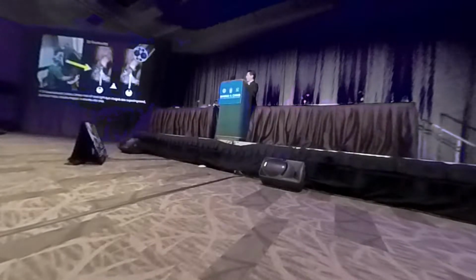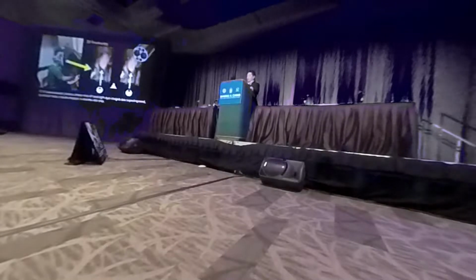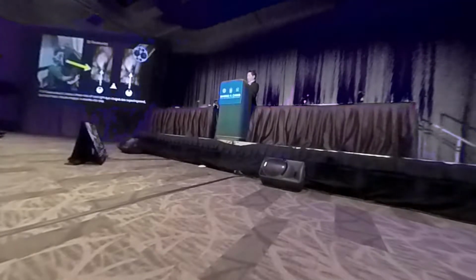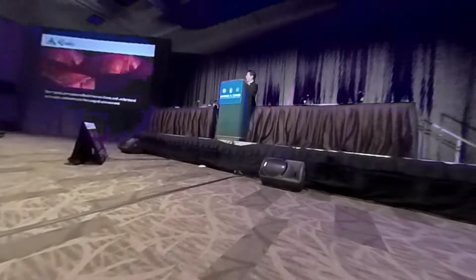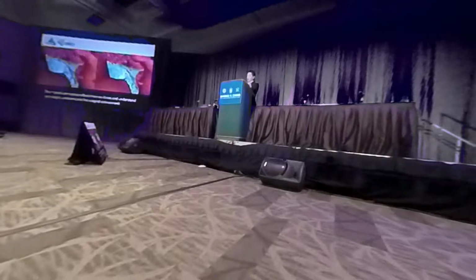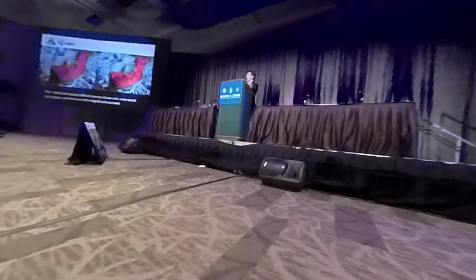So 3D endoscopy is now available for clinical usage. A 3D stereoscopic picture is one where the left and right eye images are superimposed. Our brain fuses the double images in real life into one, and we can integrate it with 3D stereoscopic medical imaging from CT scan or MRI. With poor spatial perception, it affects how we focus and understand our bodies, the relationship to the surgical environment, such as the devices, patient anatomy and the operative field.